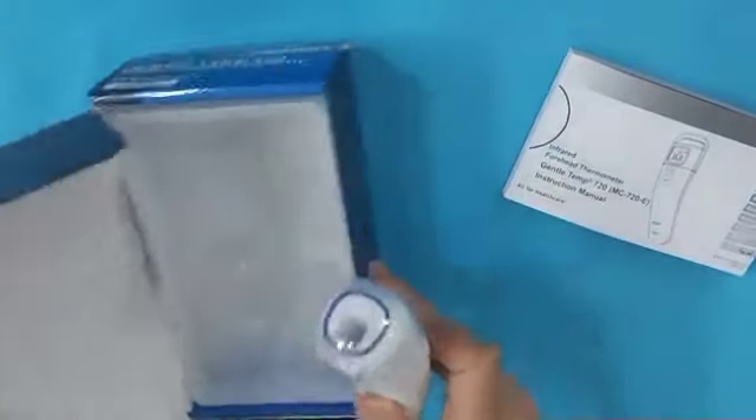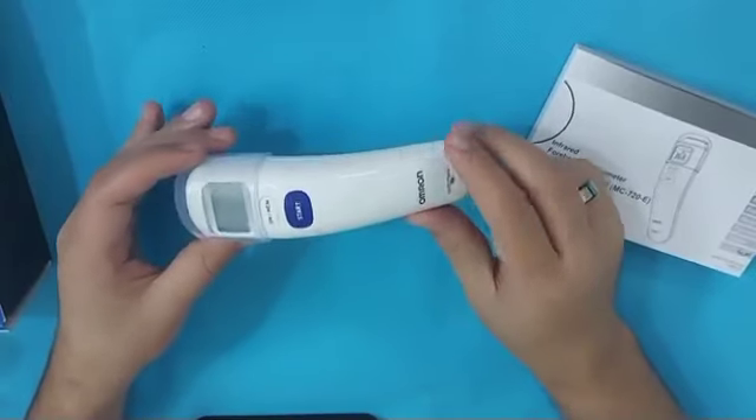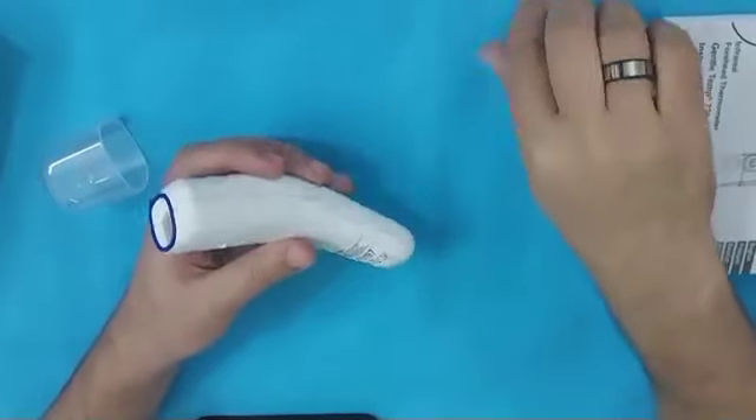The resetting of this forehead thermometer is the most significant in everyday use, so stick with me until the end of this video to learn everything about it. To begin using this thermometer, first remove the plastic insulator.